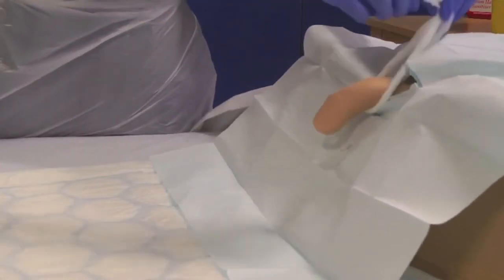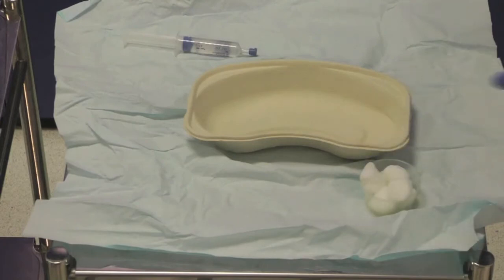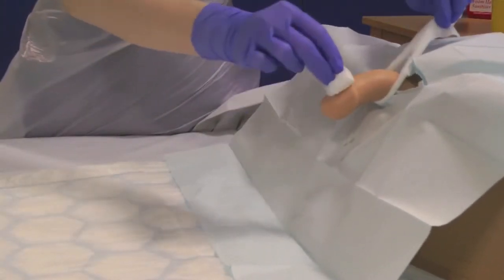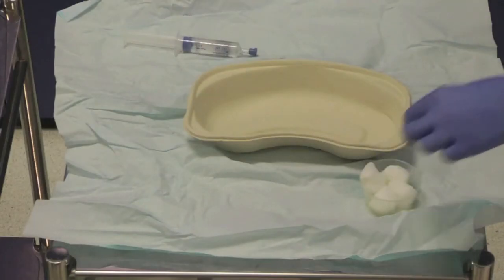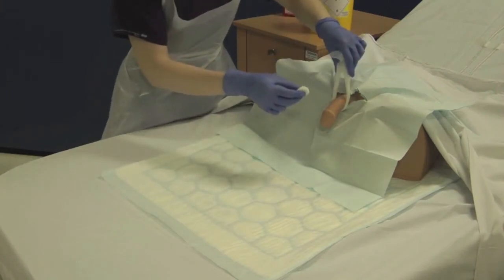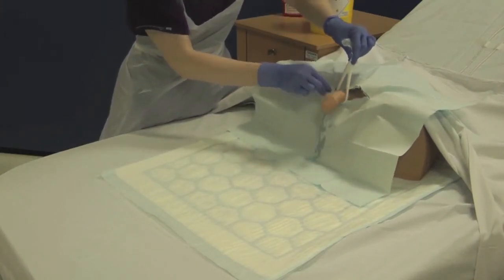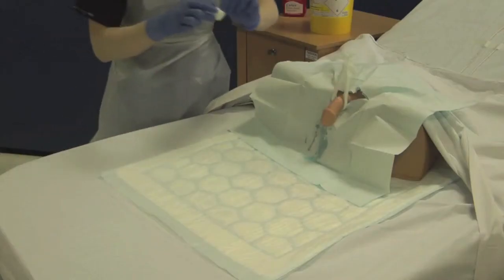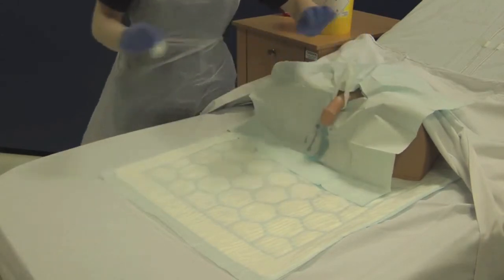If necessary, retract the foreskin and use a minimum of 5 cotton wool balls to clean the glans penis and the penile shaft from tip to base. UHL policy utilises a clean hand, dirty hand technique, as demonstrated here. Use your clean hand to pick up the sterile cotton wool balls and pass them to your dirty hand. This ensures that your sterile field is not contaminated. The dirty hand is the only hand that touches the genitalia.